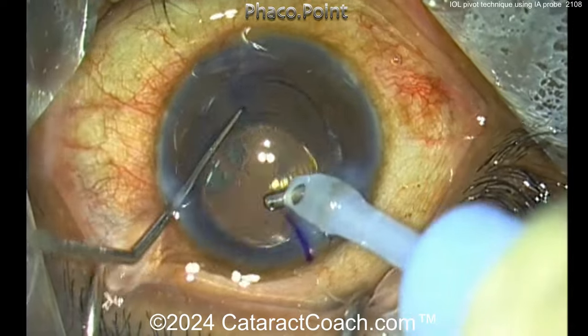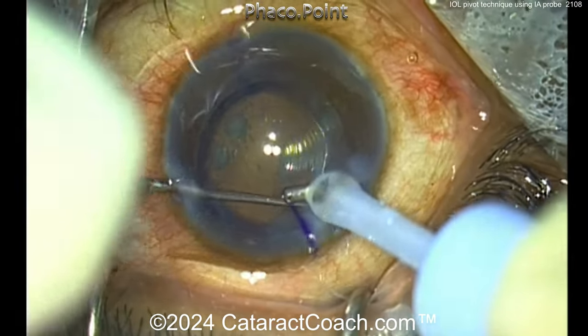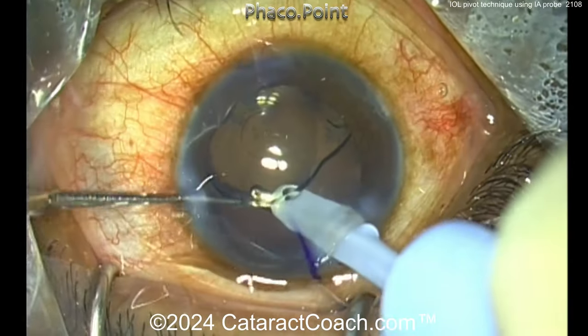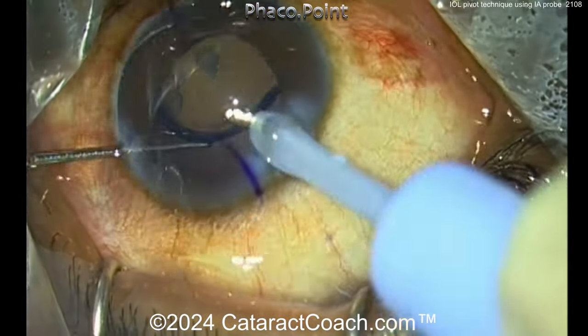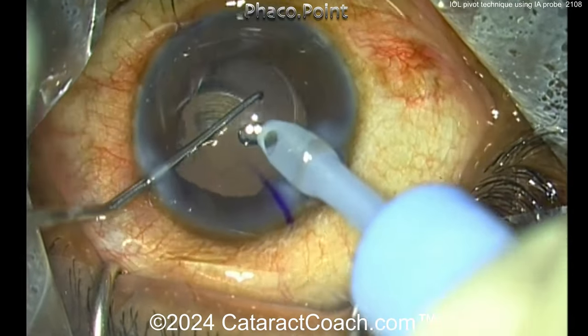We've all done the trick of putting an IOL in the bag first to help loosen up cortex, but this patient had a lot of sub-incisional cortex and this technique worked quite well for loosening it all up. You wouldn't want to leave all that cortex in the capsular bag, as it would cause a tremendous amount of inflammation. Thank you for sharing this video.